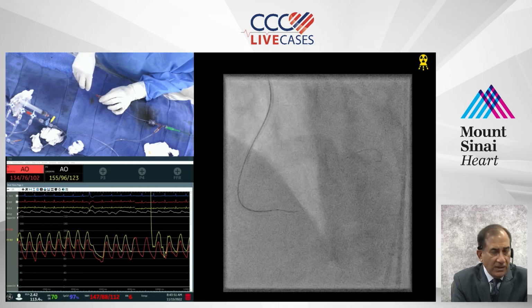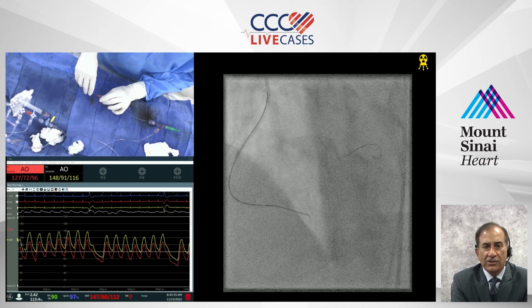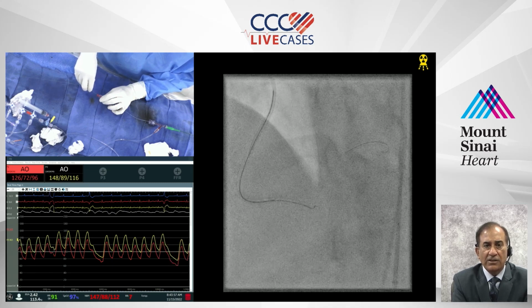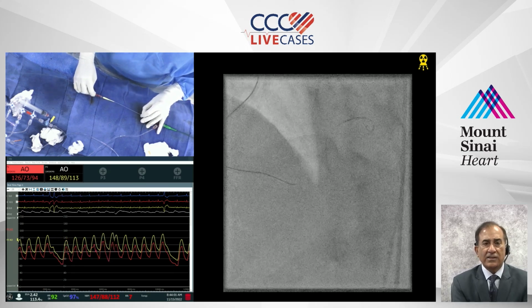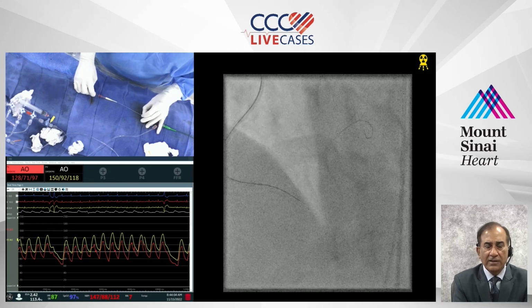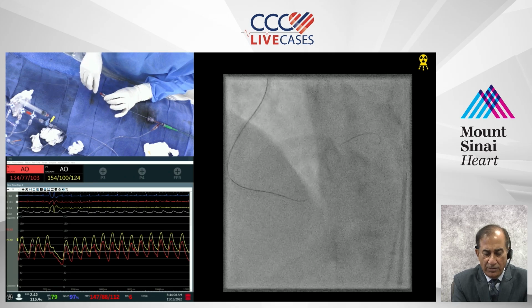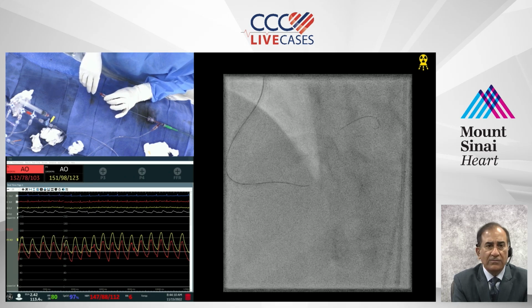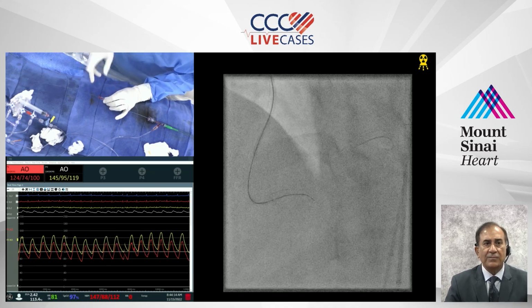It's such an excellent way to do it. Wonderful coordination with the team. That's how they save time. Often one feels all the wires are there, they go and grab it and open it only when you tell them. So, a very good practical strategy. And I've noticed it for years. I don't know why I never emphasized it.